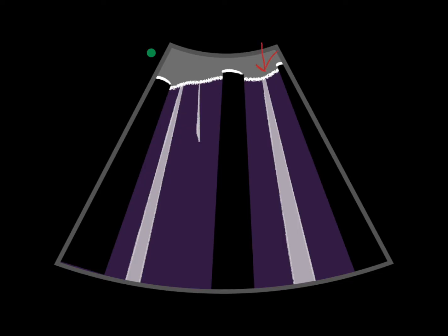This is how we get B-lines. We can see here at the top of the screen a B-line starting at the pleural line and extending to the far field, spreading out. This is why they got the name 'comet tails' — they have a leading point and extend to the deep field without decreasing in strength. A line that does not extend to the far field is not a B-line; that's essentially a reverberation artifact, occurring because of the air-fluid levels seen in lung ultrasound.